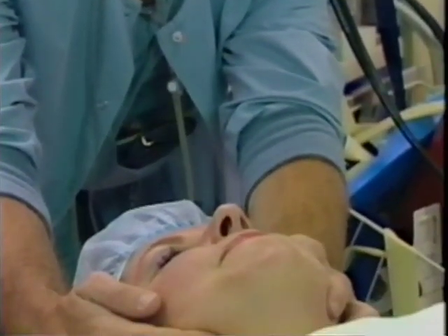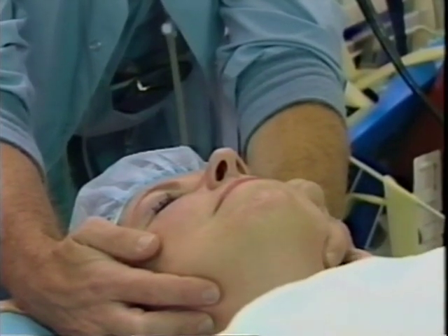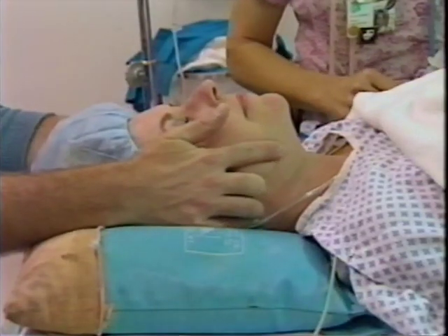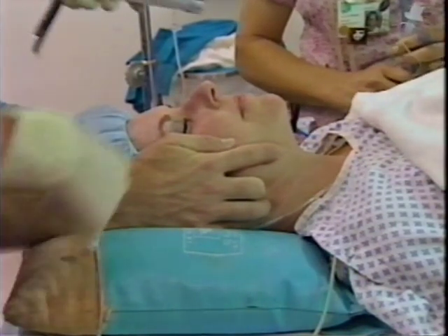If you need to immediately intubate such a patient, have a trained assistant stabilize the head and neck in a neutral position while you intubate. Lift only the mandible, not the head and neck. Gentle cricoid pressure may help, but this must be used as a last resort and with caution to avoid potentially displacing any cervical vertebrae.